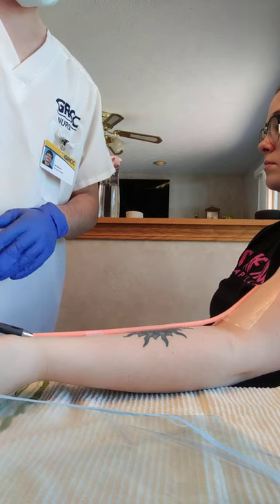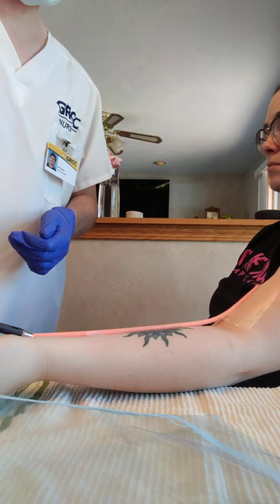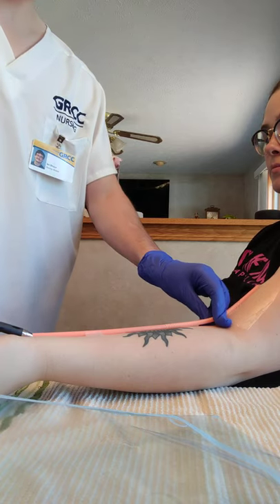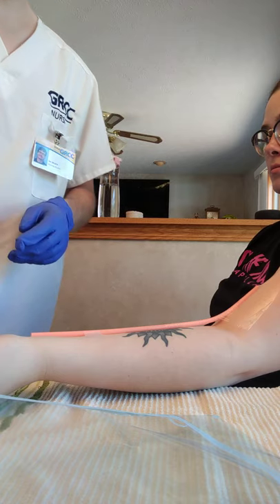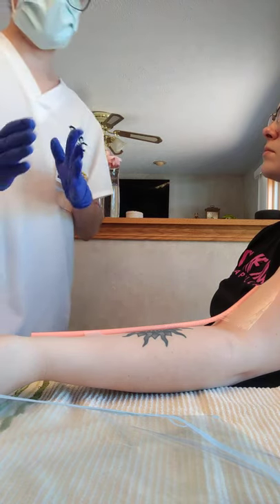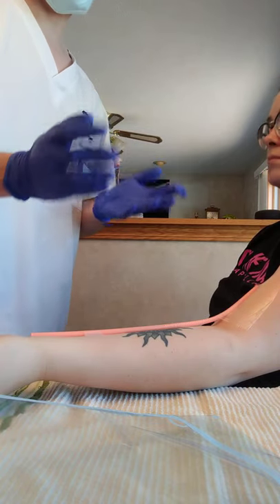Again, no signs of resistance. It's going in fine, which is great. There's no blockage. Okay, now that I've injected the locking solution, I am once again going to clamp the catheter, remove my syringe, and then I'm going to palpate the exit site of the catheter to see if there's any swelling.